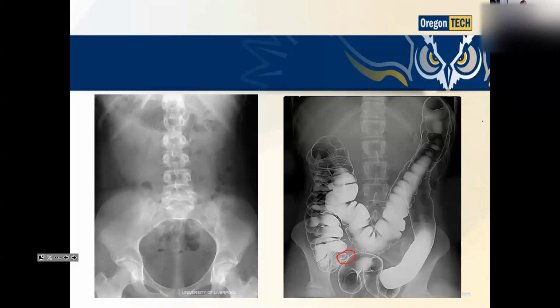Then it goes to the back, comes up over the hepatic flexure, and then when it comes across the transverse colon, right here, that comes anterior, and then it goes back posterior, and then as you get down to the sigmoid colon here, this is the cecum over here, then this goes forward again, and so the barium has moved forward in the bowel. So prone is correct.